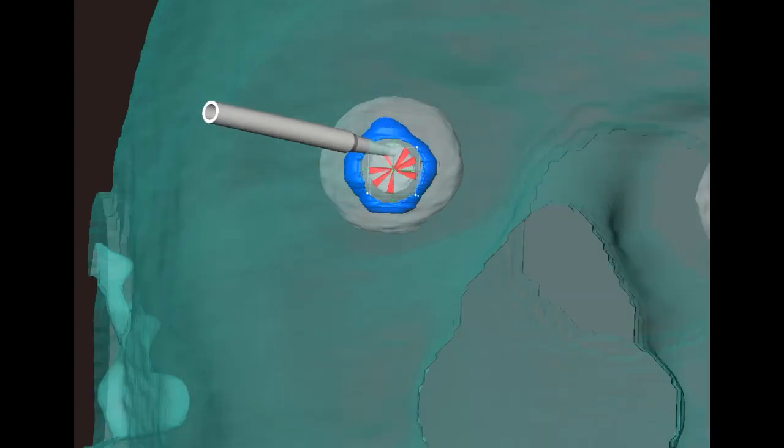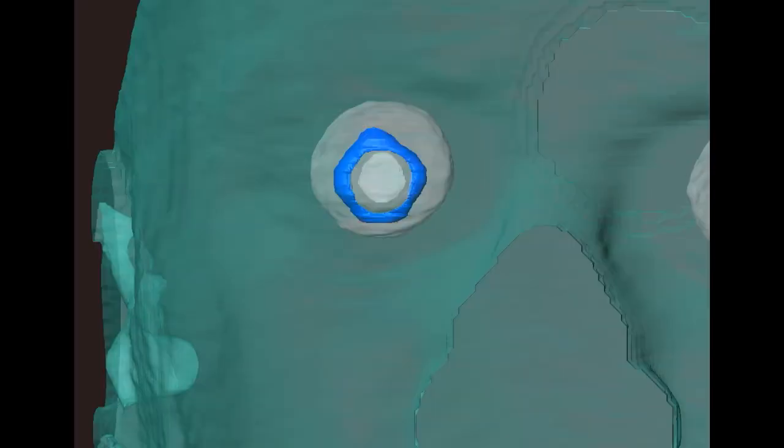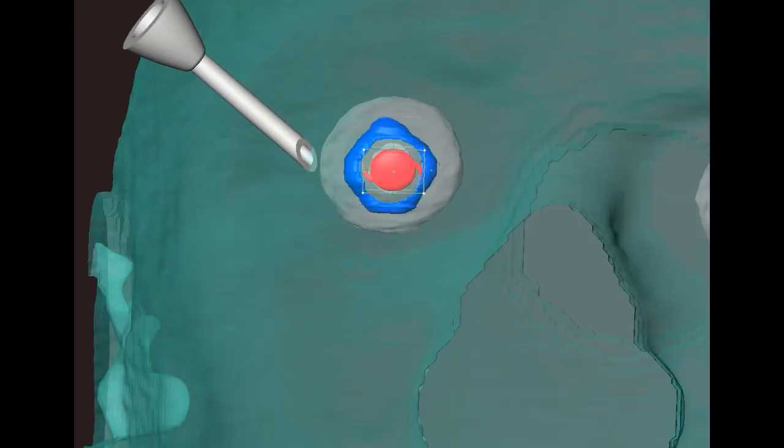The vacuuming is done in a meticulous manner throughout the entire capsular bag of the lens. And as you can see here, the lens has now been removed, and then using the intraocular lens injector, the physician will insert it into the site of the incision and release the artificial lens. The artificial lens is then moved around in a 360-degree manner to make sure that no previous lens material is still present. That is the end of the experiment.